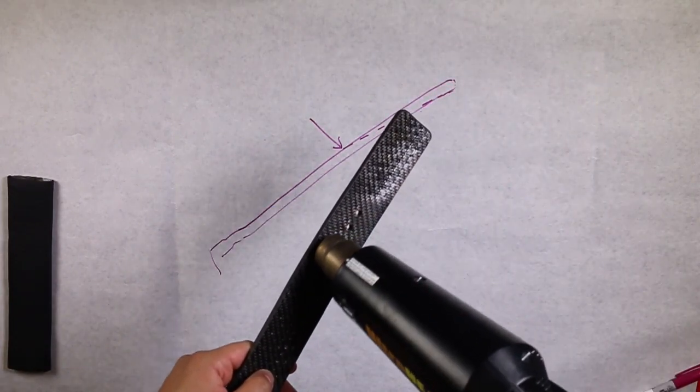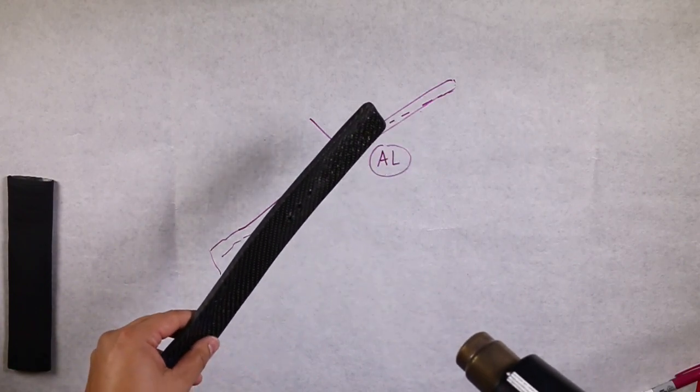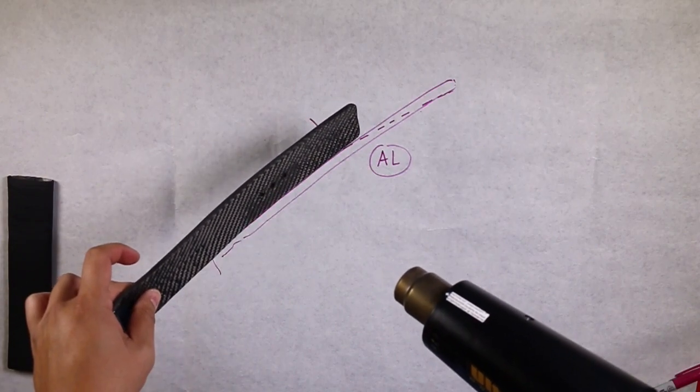To heat the strut, use a heat gun on high setting located approximately four to six inches from the surface of the strut.